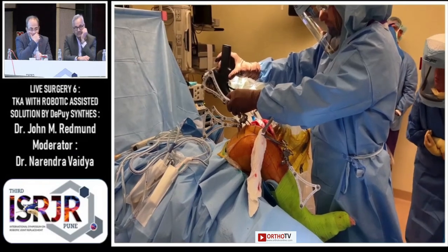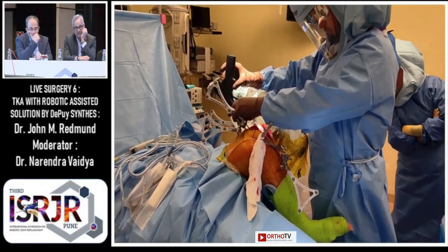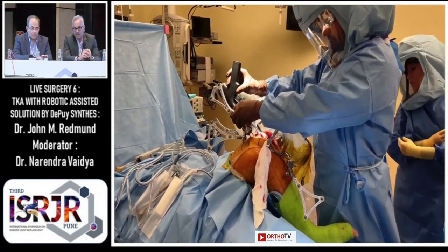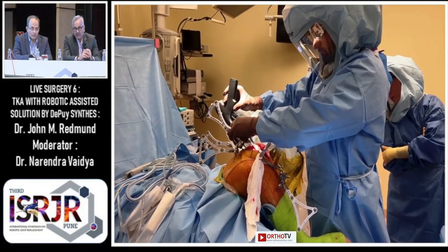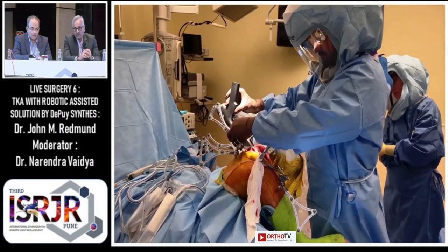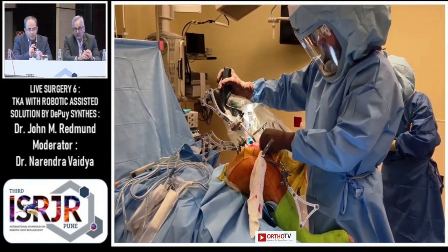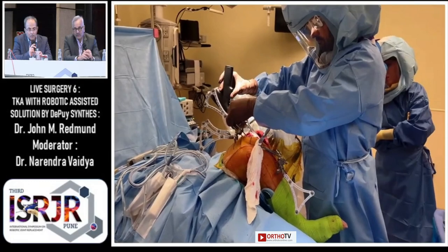You let the robot come into plane, and once it finds its plane you engage the trigger. This is very similar to cutting with a cutting block or traditional total knee, but the robot keeps the saw blade in plane. If the leg moves or you push on the saw, the robot cuts power to the saw so it cannot cut.